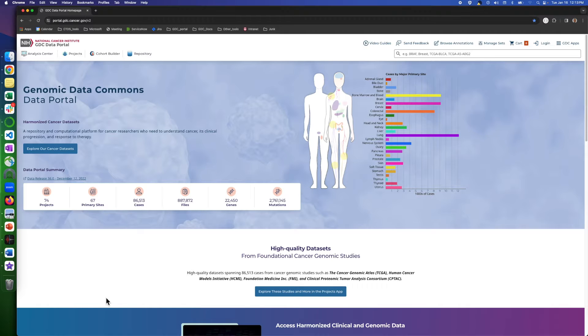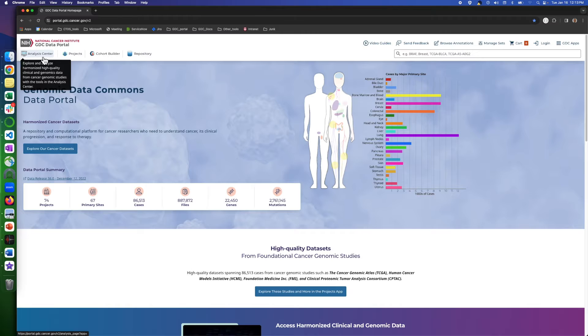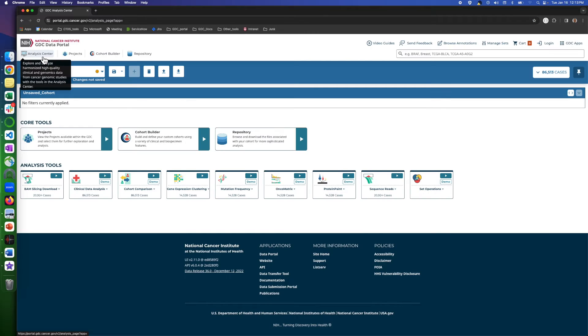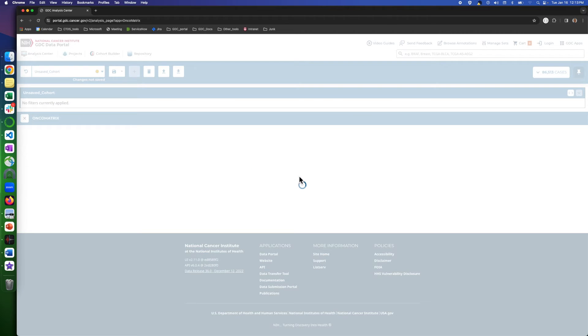To get to this page, on the home page, click on the Analysis Center on the top left. Then, in the Analysis Tools section, click on the Oncomatrix play button.